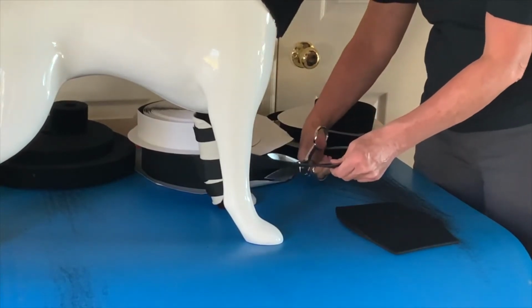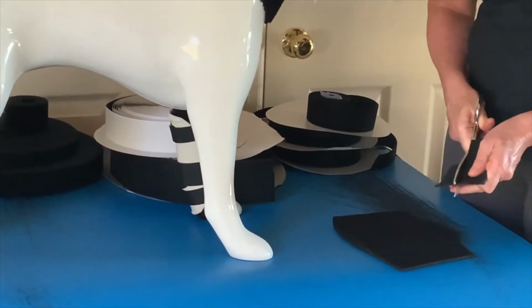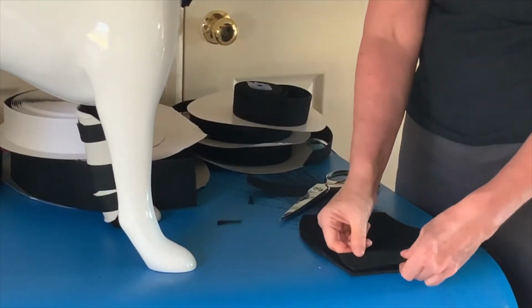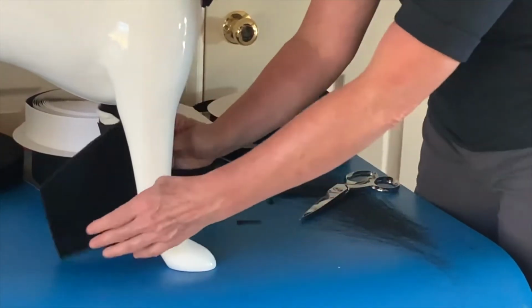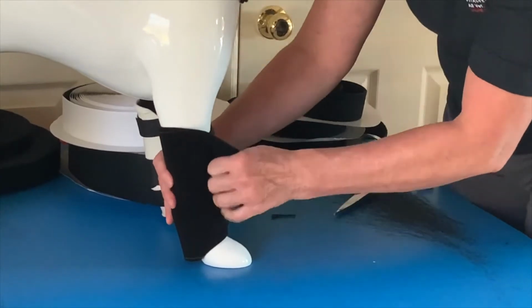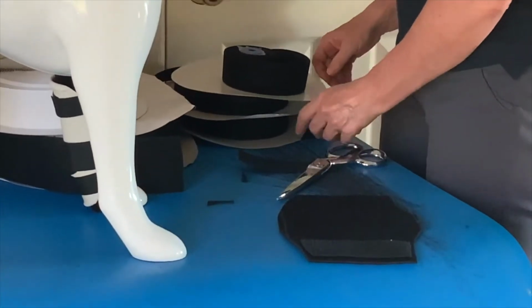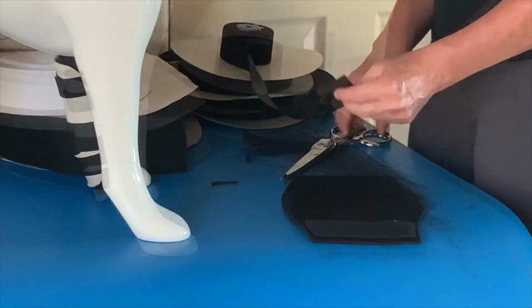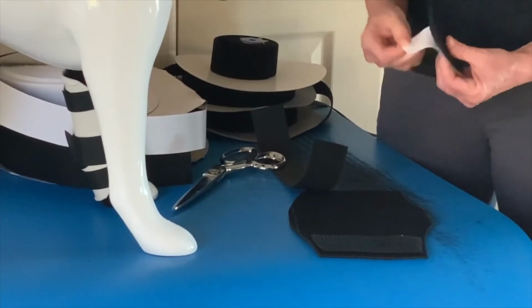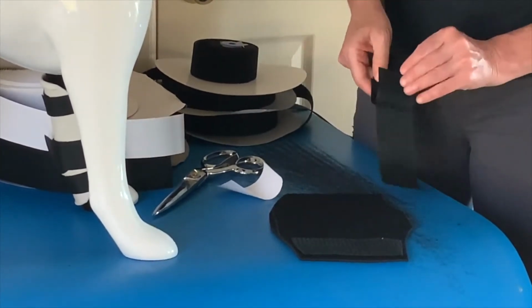For the closure, use double-sided hook. That looks pretty good. Now we're ready for our straps. The middle strap should be the widest strap as it's going over the key joint, in this case the carpus. For this brace we're using a 2-inch wide middle strap.